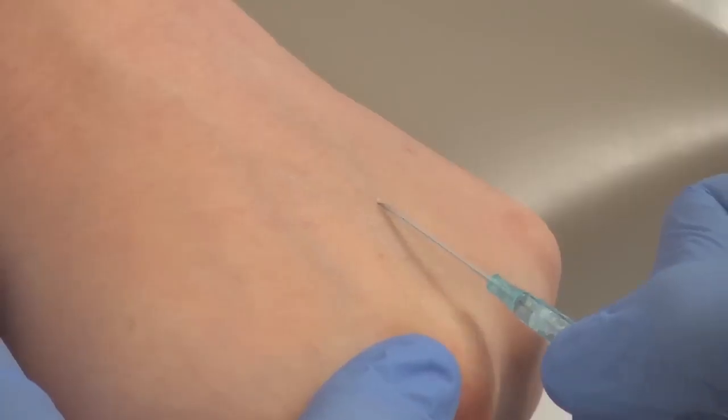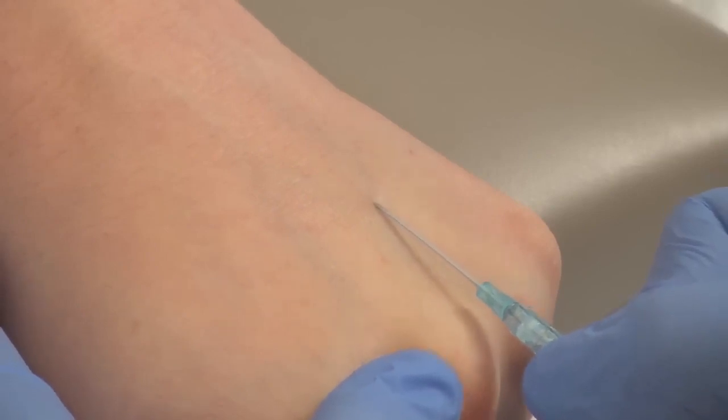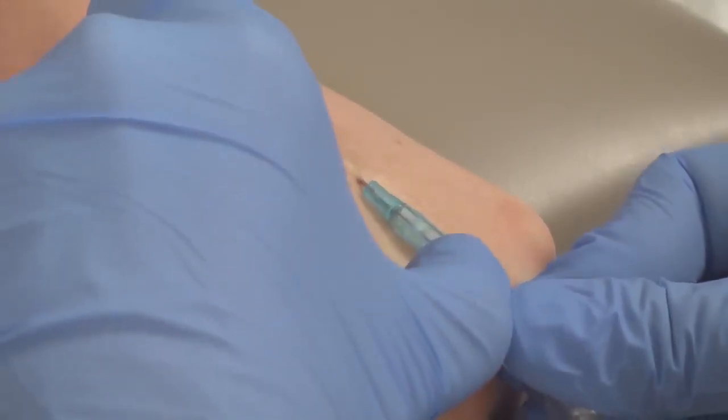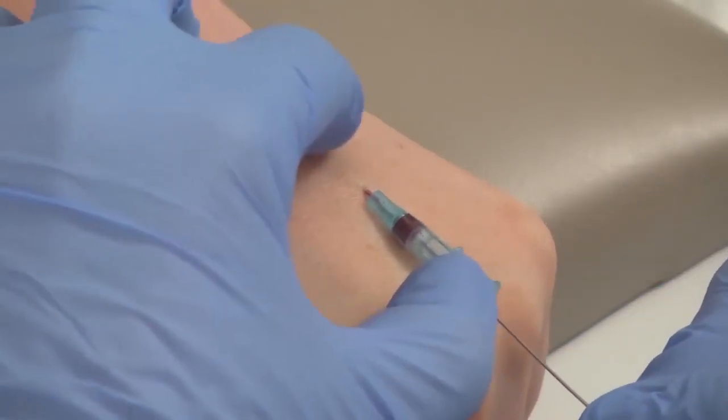Have the angiocath bevel up at a 10 to 15 degree angle as you insert the needle into the skin. As you advance the needle, you will see a blood flashback to confirm you are in the vein.